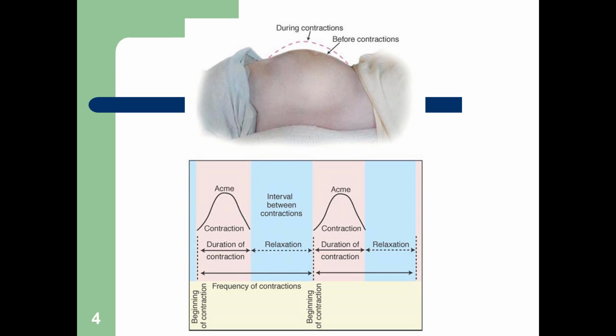So here's a picture during contractions and before contractions. As the patient contracts, there's a rise in the uterus here, okay? And again, this is just a reminder of what you have had in the past. We've got the acme, that's the uppermost point, okay? And then your interval, the relaxation period, okay? So again, that's just a picture that'll help you to see it a little bit better.